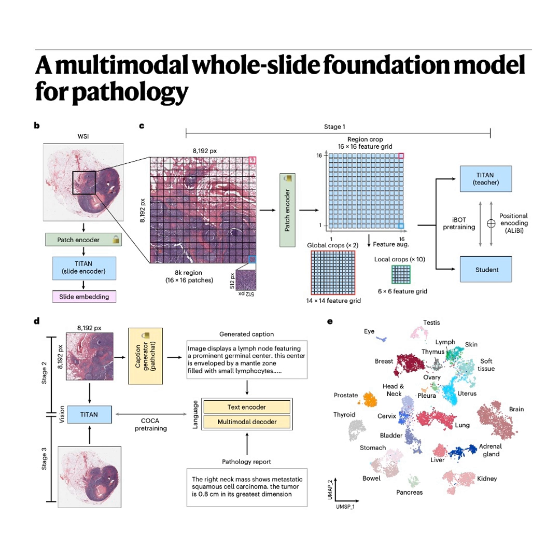Precisely. And Titan significantly outperforms other encoders here, with a plus 14.8% higher average accuracy in retrieving relevant cases. But crucially, think about its robustness to what we call domain shift. You mean, does it work in any hospital, regardless of their specific equipment? Yes. On the rare cancer external cohort, which came from a Japanese institution, completely new scanners, new staining methods, Titan achieved plus 30.8% higher accuracy than the next best model. That proves it's a true general-purpose tool.